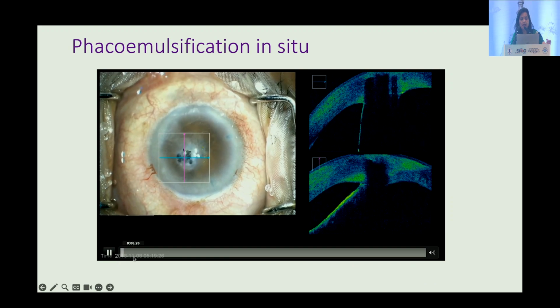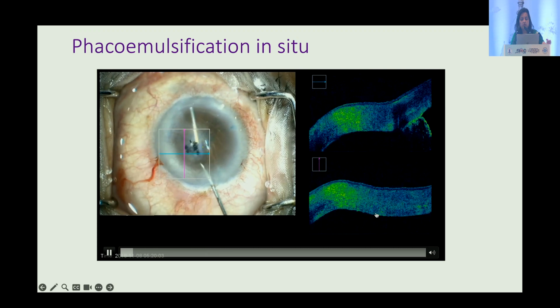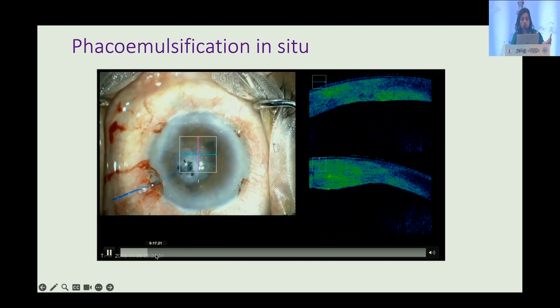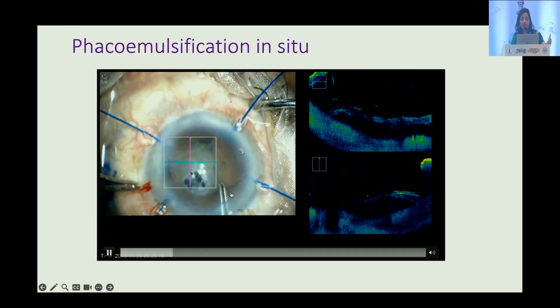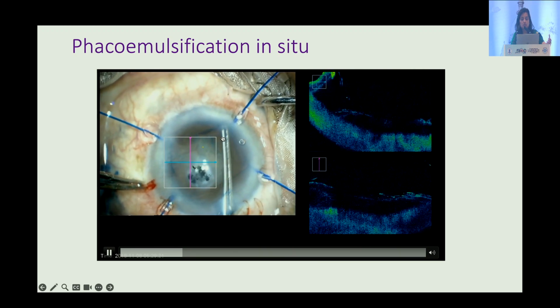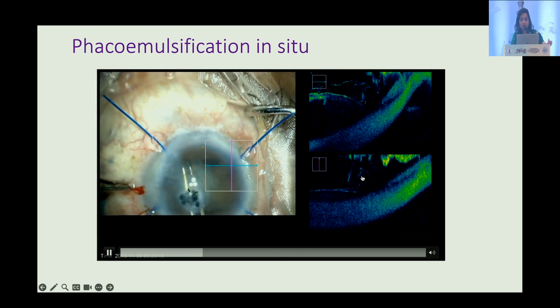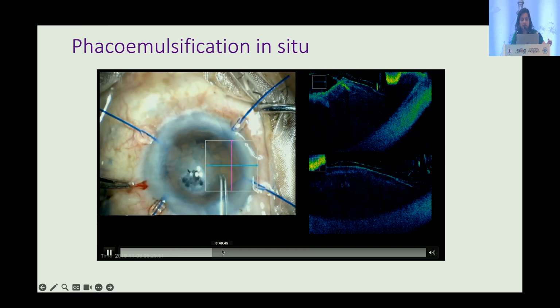Now this is a black and a white cornea because of the haze, and black because it is tattooed. And you can see that there is synechia here, and the synechiolisis is done, and subsequently because the pupil is small, you have to expand your area of visualization, so nylon hooks are placed, and then again use the capsulorhexis forceps, because it gives you a better control. Don't lose the edge of the rexis underneath the haze, because if you lose it, it becomes very difficult to pick it up. Of course, intraop OCT microscope does help you to pick up the edge of the rexis, but if you don't have it, then it becomes difficult to pick it up.